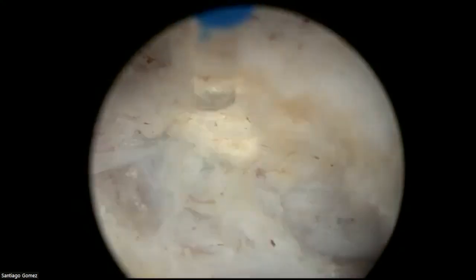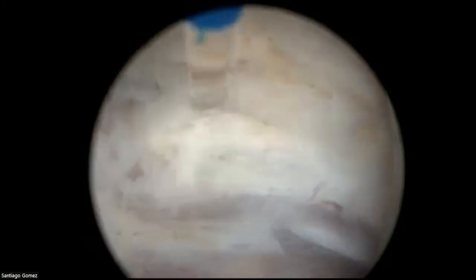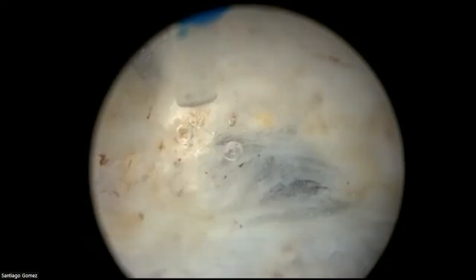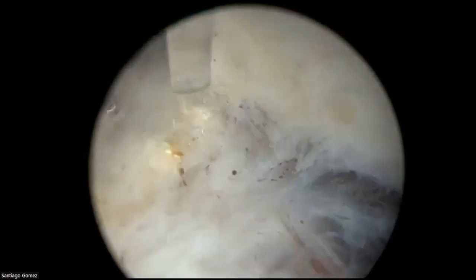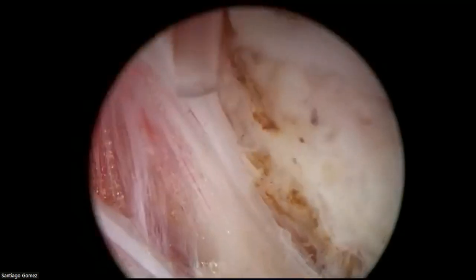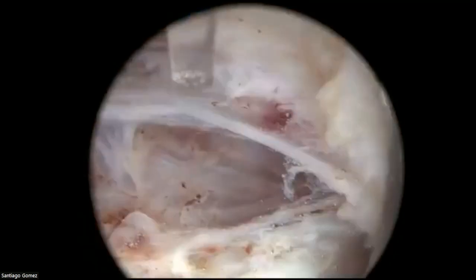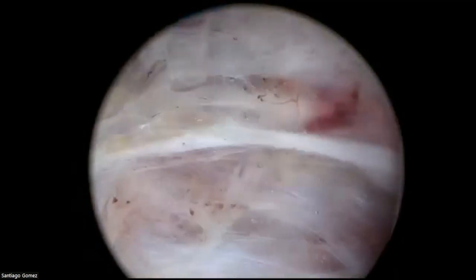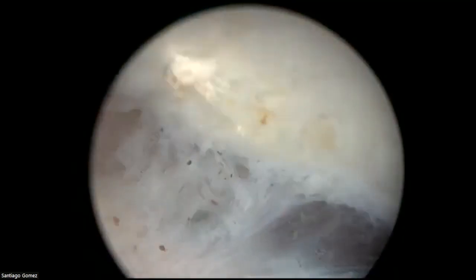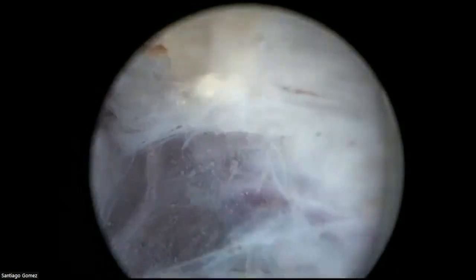But of course, we haven't spoken about the attitude you have to have for HoLEP. And I think it's almost as important as the technical aspects. You have to be very relaxed when you do HoLEP, and you have to be very technical, not emotional, but technical. And if you see a deepening in the capsule, a perforation, something like that, you shouldn't panic.